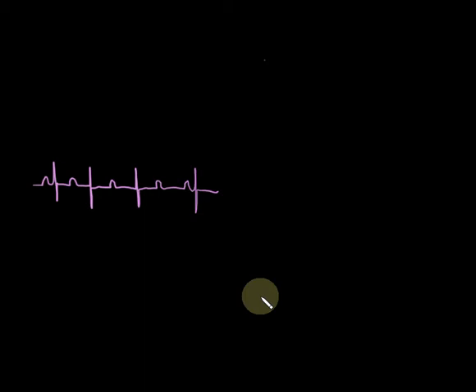So if we look, QRSs are nice and narrow. P waves are upright, round, symmetric. PR ratio, well, oh, it's 1 to 1. No, not quite. What do we got here? I've got 2 P waves before the QRS. So this is not a 1 to 1 PR ratio. That becomes very important on here. It's more P waves than QRSs.